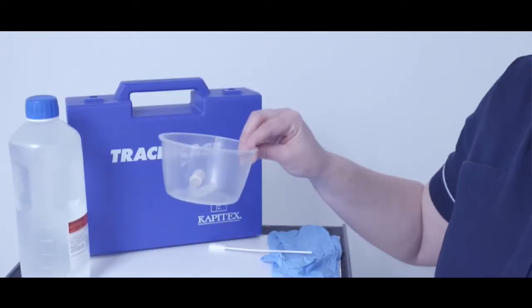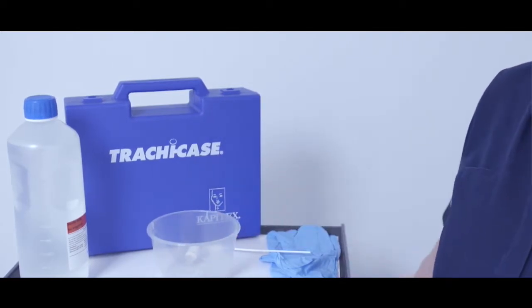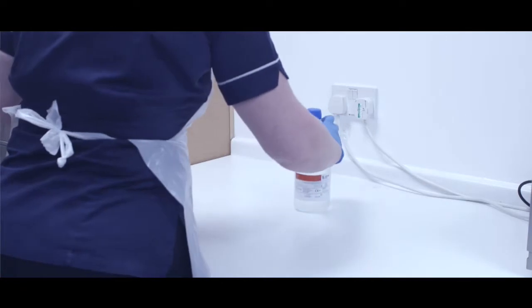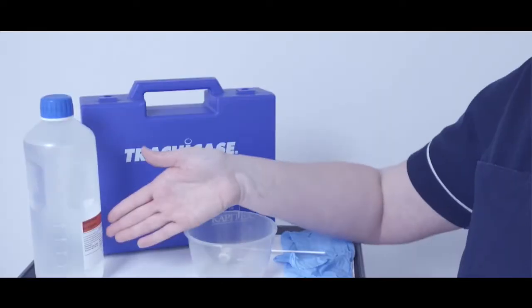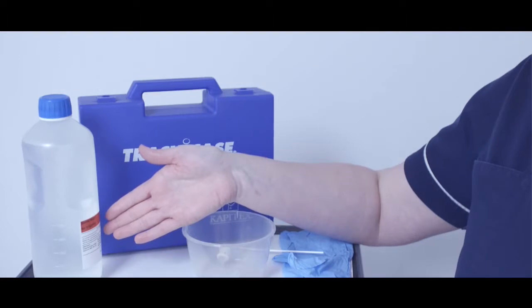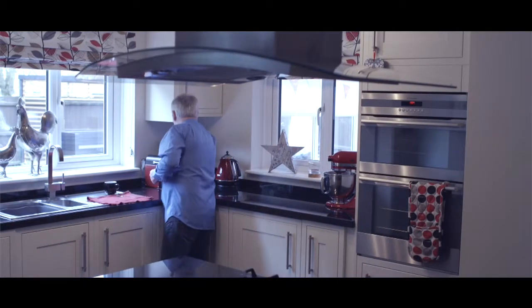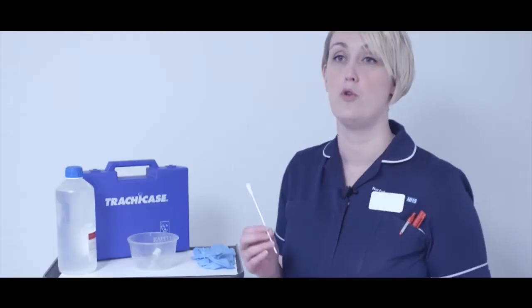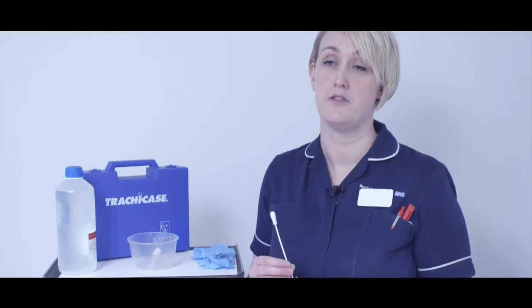A spare inner tube should be available at all times. The spare tube can be kept in a dedicated clean sterile bowl, which should be changed once a day. The tube itself can be either disposable or for reusable use. Sterile water should be used in a clinical setting, but in a home environment it may be adequate to use boiled and cooled tap water — advice regarding this will be given before discharge. The inner tube is cleaned using a cleaning swab or brush, which should be replaced every day or after each use depending on the manufacturer's guidance.